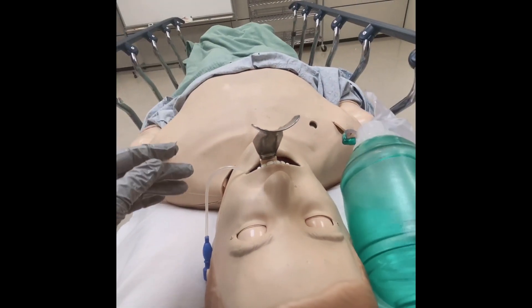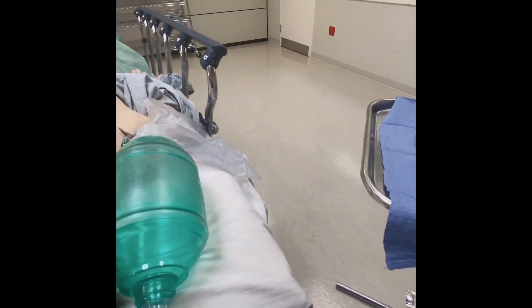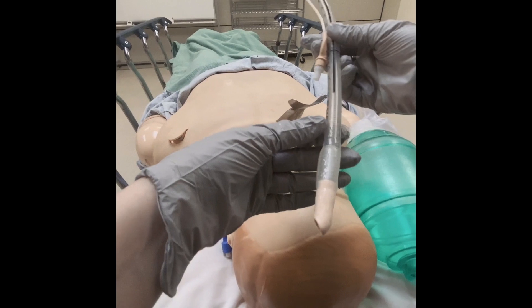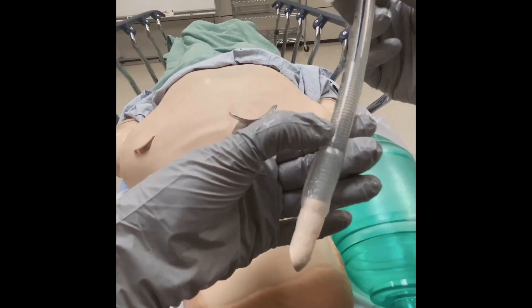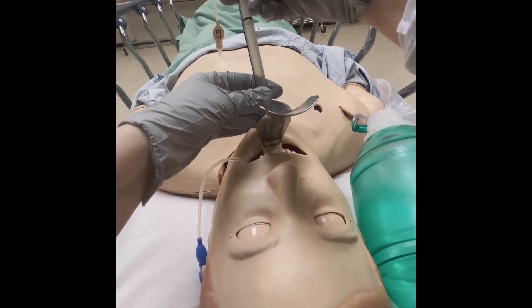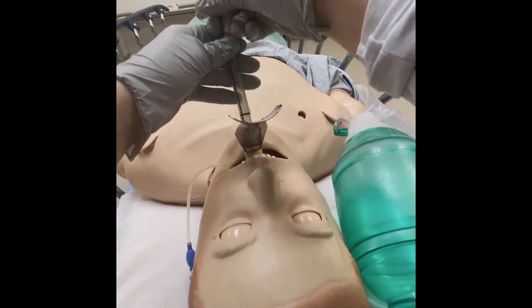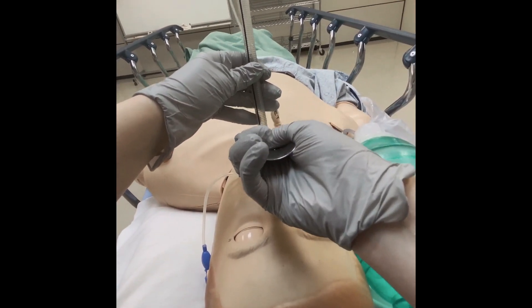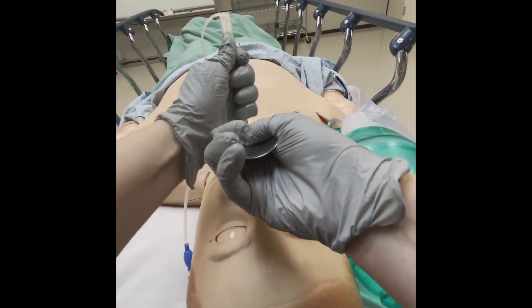Once you have confirmed LMA placement, you're ready to insert the ET tube. Ensure that the ET tube has plenty of lubricating jelly and the cuff is deflated. Simply insert the ET tube through the LMA. If you meet any resistance, adjust the LMA using the handle. The ET tube should go in smoothly without resistance.